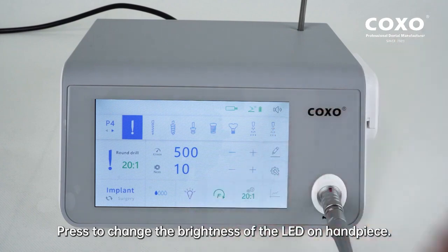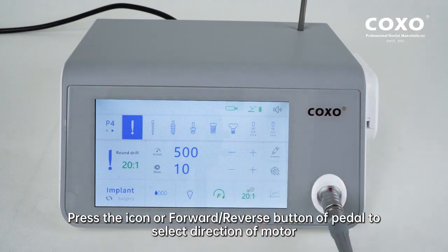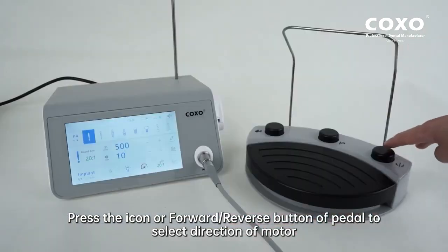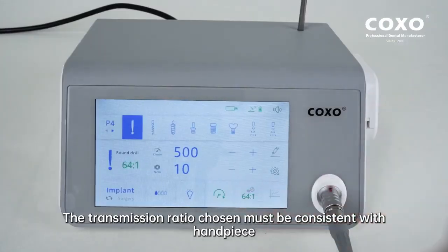Press to change the brightness of the LED on the handpiece. Press the icon or forward/reverse button of the pedal to select the direction of the motor. Press the icon to select the transmission ratio. The transmission ratio chosen must be consistent with the handpiece.